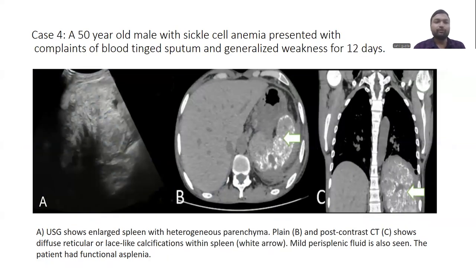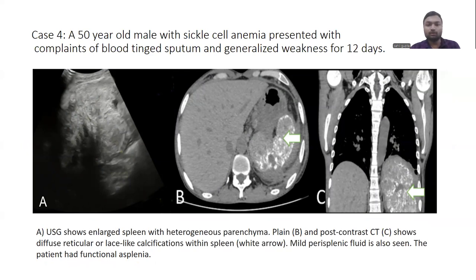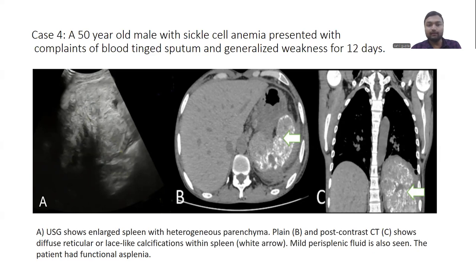Case 4: a 50-year-old male with sickle cell anemia presented with blood in sputum and generalized weakness for 12 days. Ultrasound showed a large spleen with heterogeneous parenchymal echotexture. On non-contrast CT, there was diffuse reticular or lace-like calcification within the spleen, with mild perisplenic fluid. The patient had a functionally asplenic spleen.